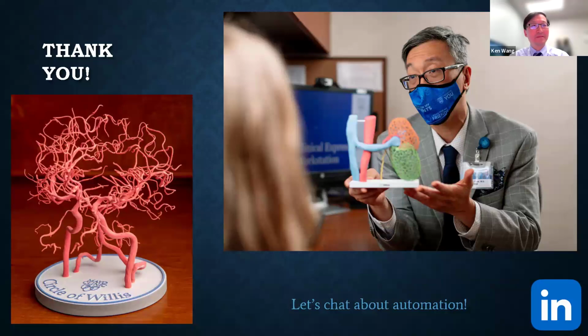Yeah, makes sense. Here's another question. This one comes from Brian Patterson. He says, great talk, thanks for sharing. And he asks, what is your QA process like to verify that your scripts are not modifying the accuracy of your finished models? I think end of the day, you are copying and pasting back into your segmentation platform to ensure accuracy. But I'll also say that the script itself is largely a manifestation of what you would have done manually anyway. And that ties to repeatability of your process.